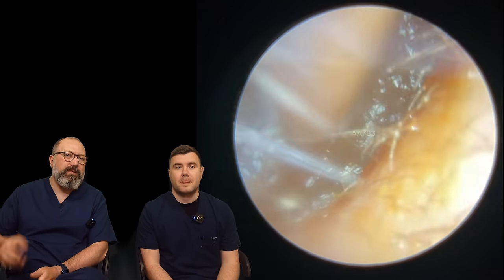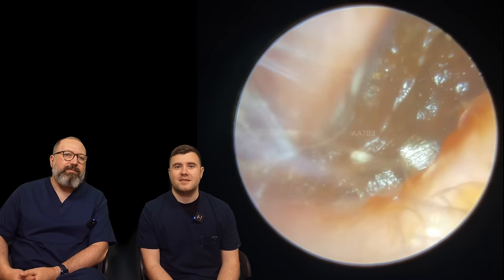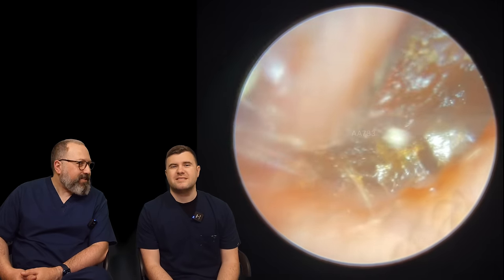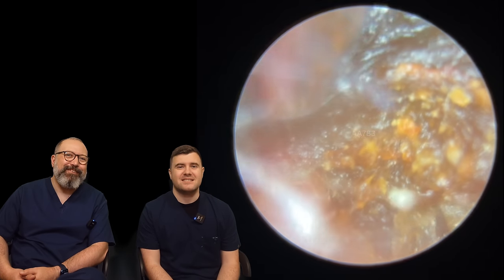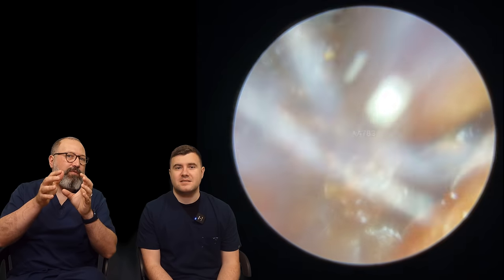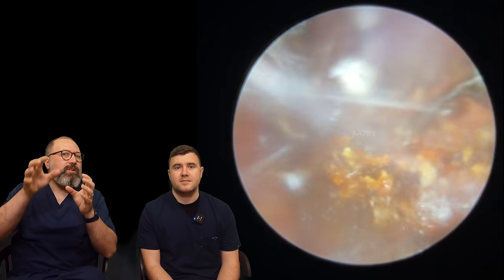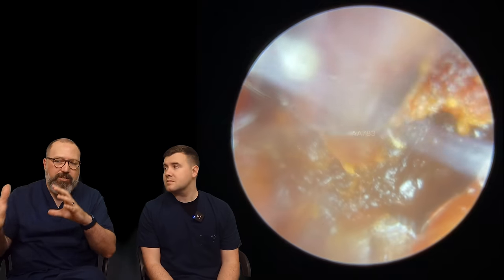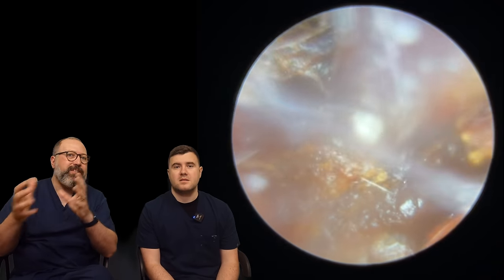This first patient is mine. We've got a bit of a mixed bag today, mine and Taylor's in here. This first patient has very, very super sticky wax — really sticky wax, it doesn't budge easily. The difficulty I always find with these is I always try and detach from the canal wall first, and what I find is when I've detached from the canal wall with this very super sticky and softer type wax, it just moves from site to site — it doesn't actually detach.